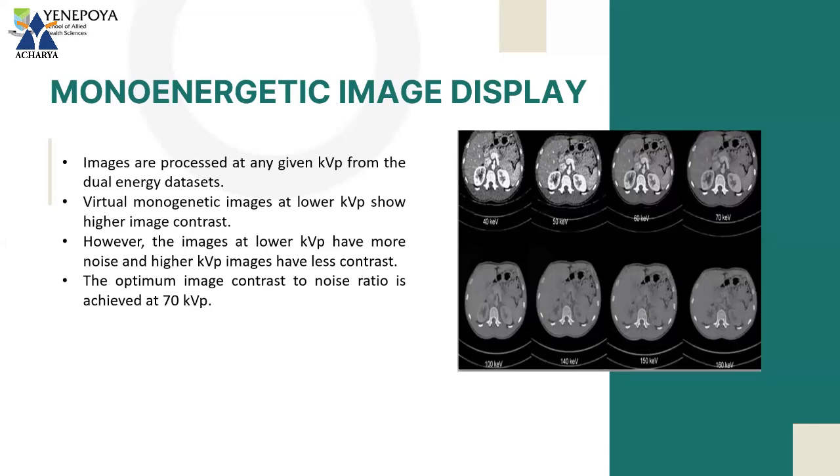Another question is, what type of filters do we use in twin beam sources? What type of filters are used in twin beam sources?